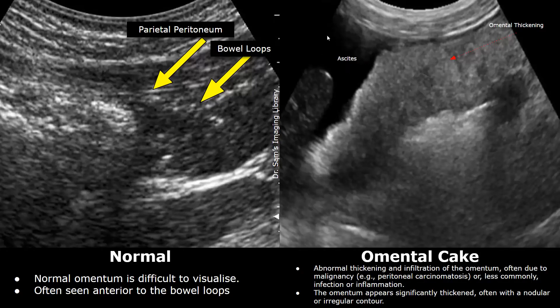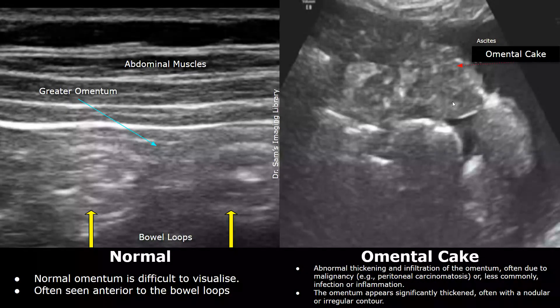Here, we can see anechoic fluid. The thickened omentum usually has irregular or nodular margins. This is how an omental cake appears. Here is another case showing an omental cake — a prominent thick heterogeneous structure is seen, along with ascites.